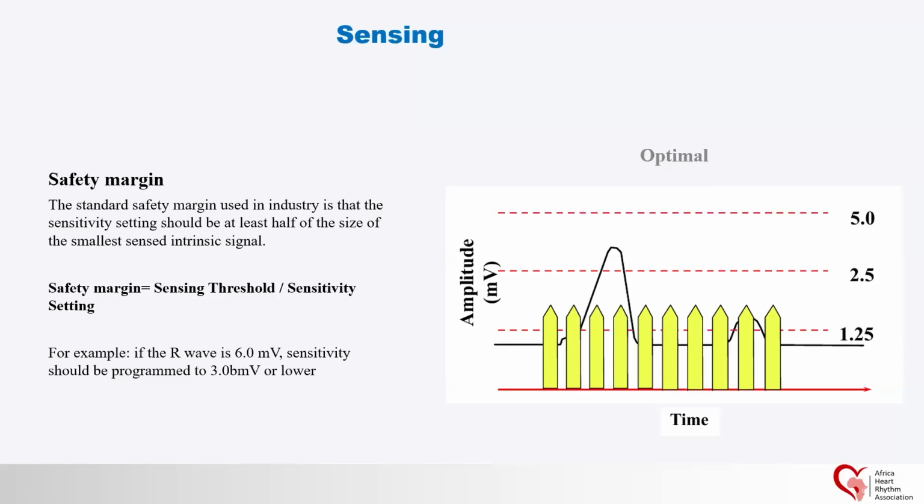When we talk about the myocardium, we talk about atrial myocardium and ventricular myocardium. This is very important because we will place the lead in a position where the pacemaker can detect the intrinsic activity, to minimize the pacing, and this can also help improve the pacemaker longevity, or the battery longevity.